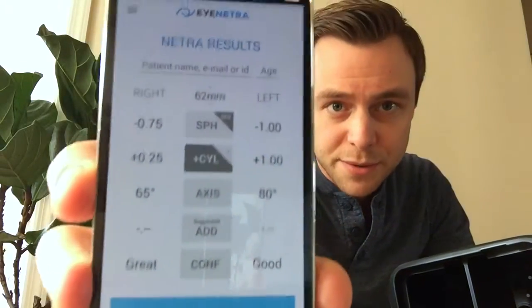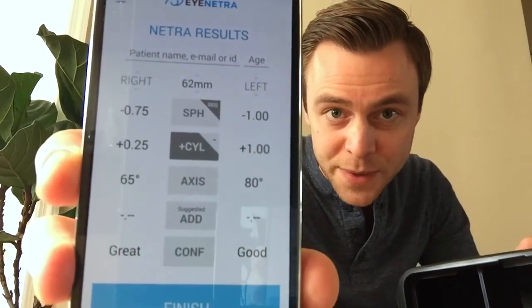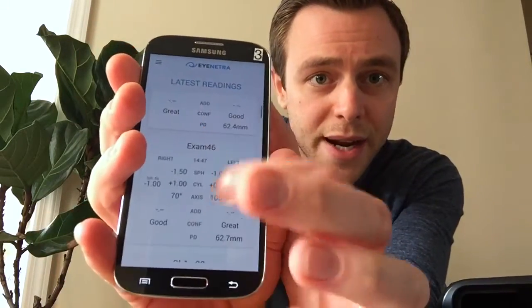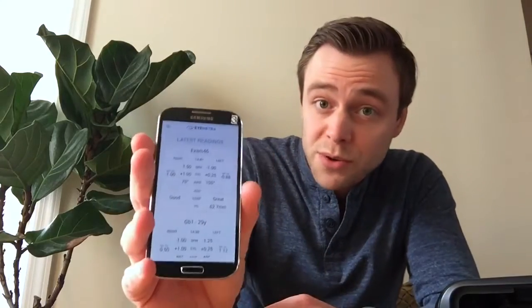That was easy. To find my results, I just pop out the phone, and my results are displayed right on the face of the phone. I can tag those results with a patient identifier — for example, GB1. Selecting the dropdown menu in the upper left-hand corner and choosing readings, all my readings are there and accessible at any time. In addition to being stored on the phone, all readings are also stored on our online secure patient portal at insight.eyenetra.com. You log in with the same credentials used to log into your EyeNetra phone.